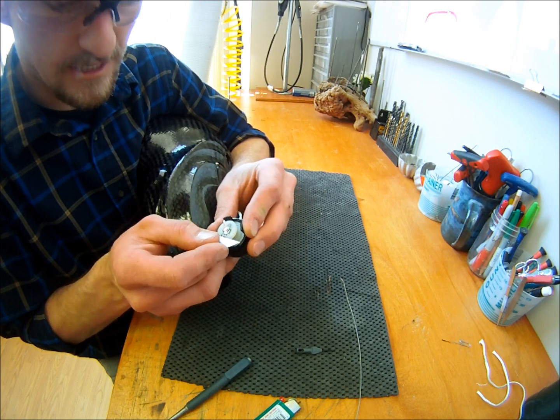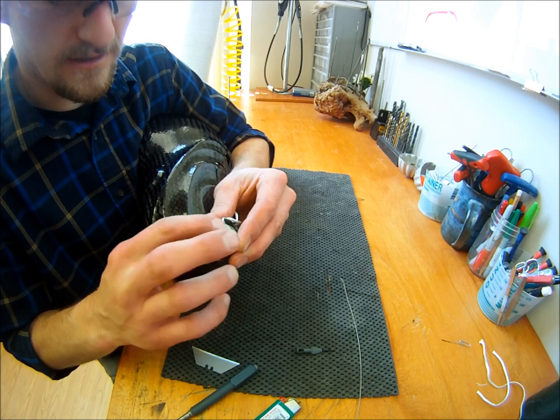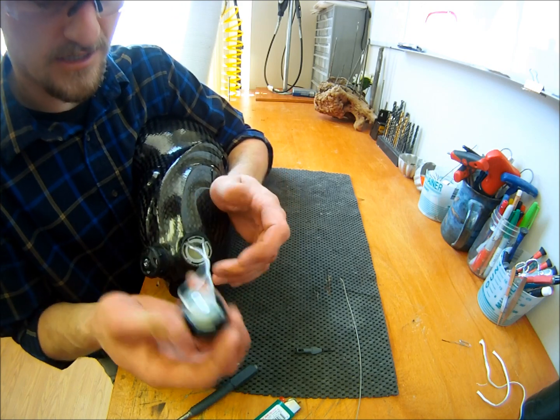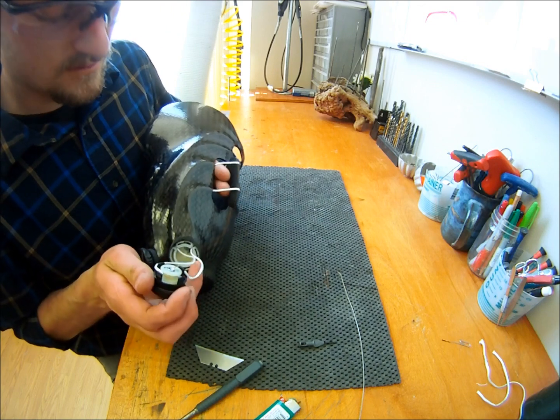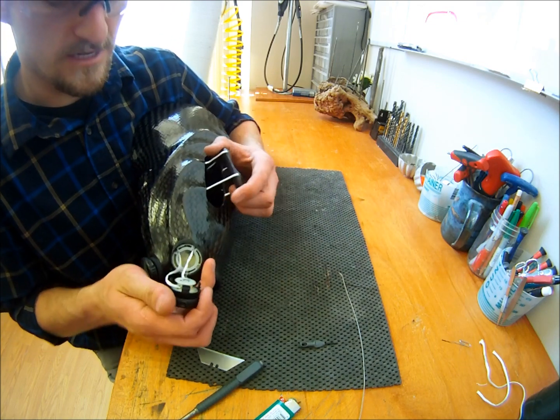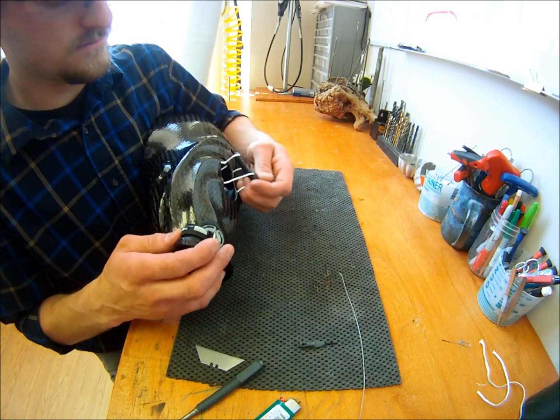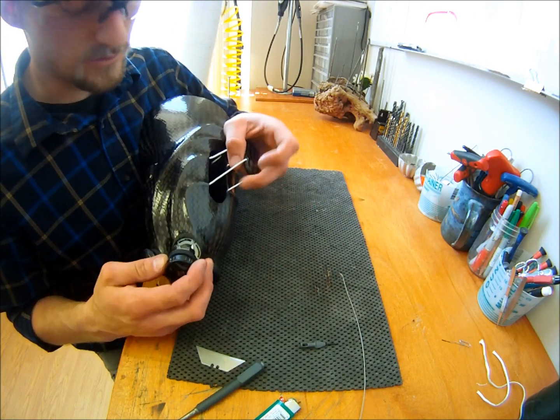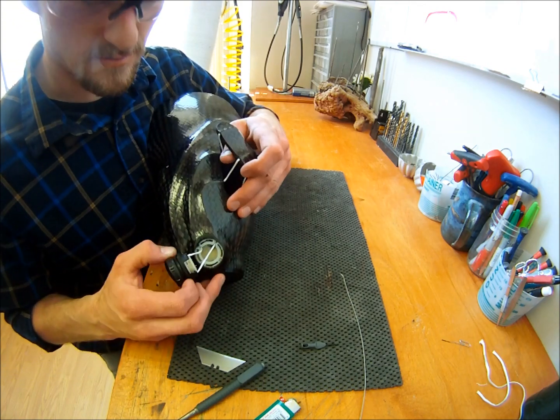If you don't have the tool, again, you can heat it and push the rest into the recess. So there's nothing left. It's nice and flush. It's not going to catch on the bottom of the spool there. So then you can pull out on one of the panels to get all the slack out of your base there.